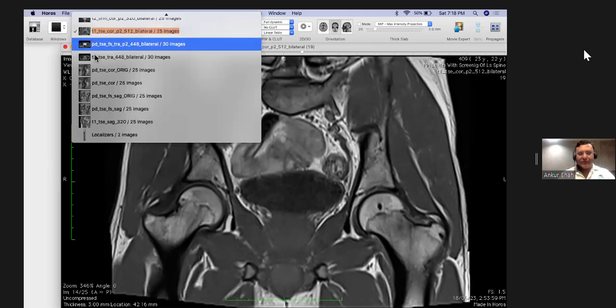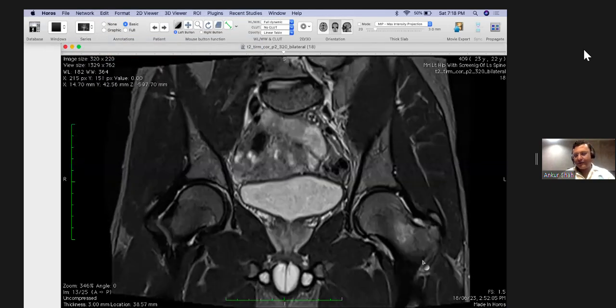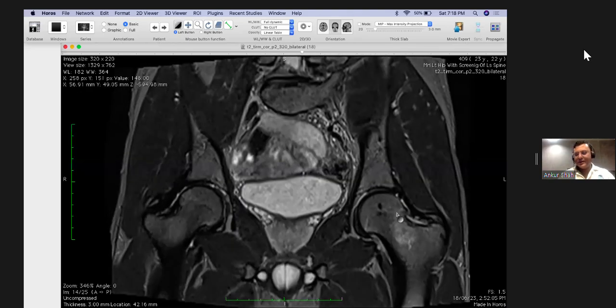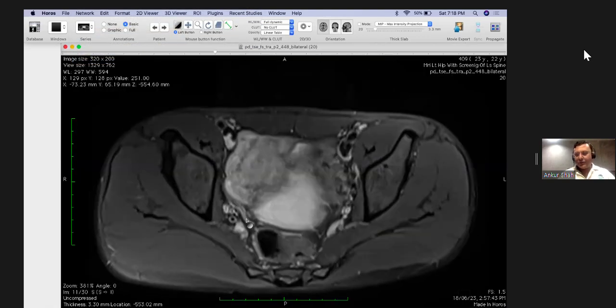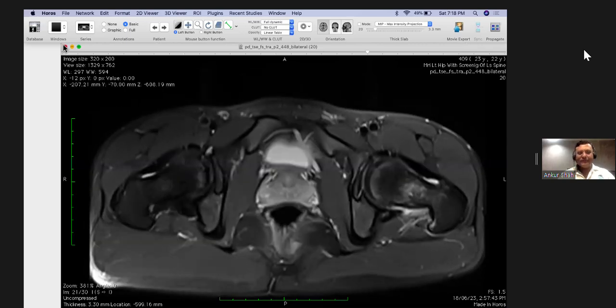Again, here, if you look at this femur, the patient presented with pain in the hip joint. Again, it looks like a very unusual site of marrow edema. Why should marrow edema occur at the superior part and not here if it is because of the stress injury? And these areas of marrow edema, whenever you see, always look carefully, and you might be able to find a small nidus in this region as here. And that was a small osteoid.